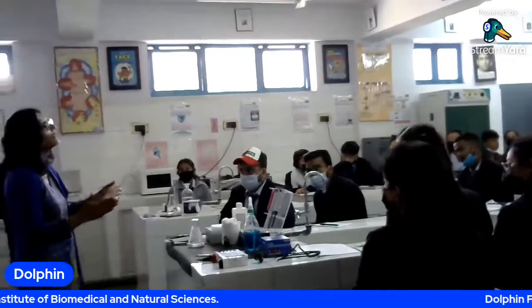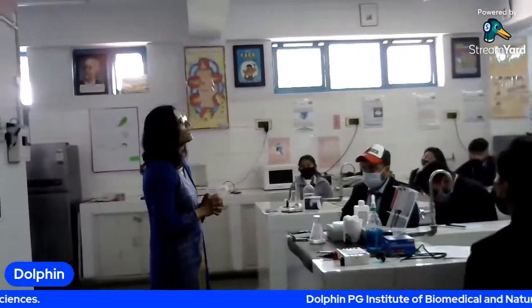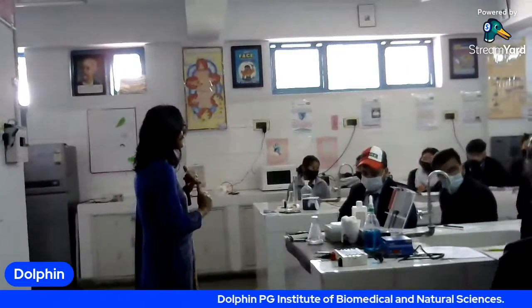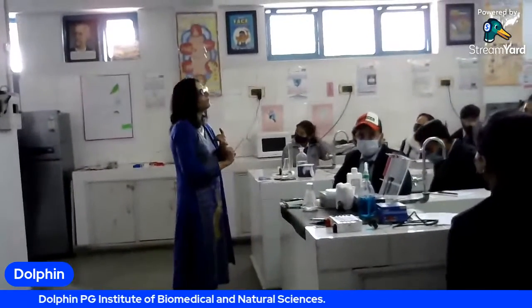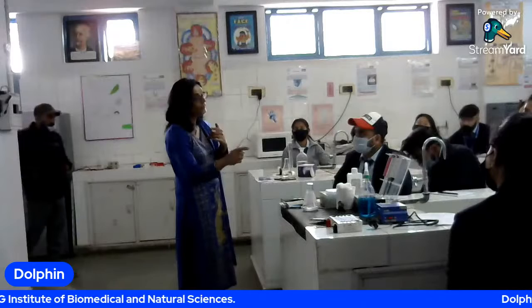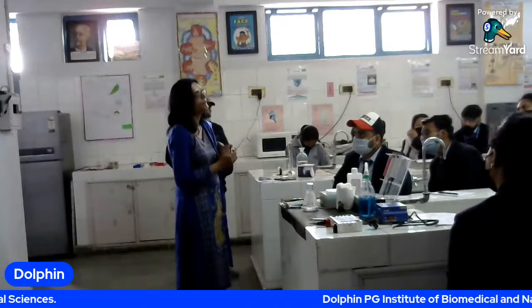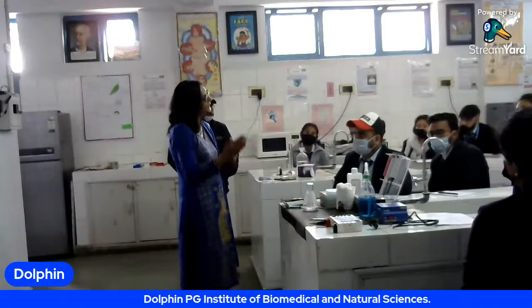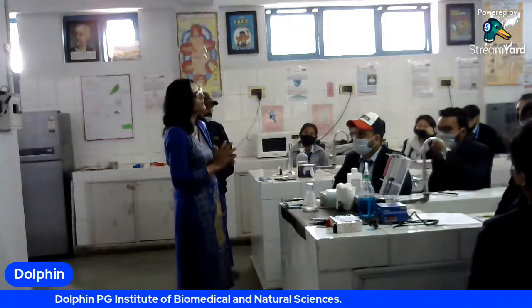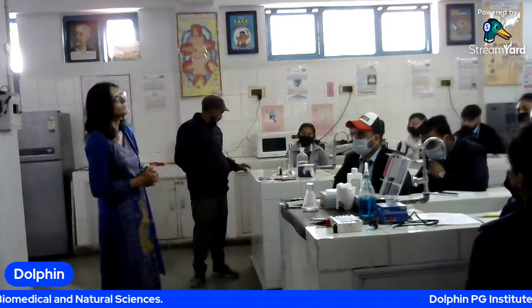What we have to do is take only anions, and we are moving them towards the anode. So the antigen is such that we have made it negatively charged. If you are doing it for positively charged ones, that will change the buffer capacity and the charges on the buffer. So the technique can be modified for positive ions, but that will require a lot of change in the setup also.